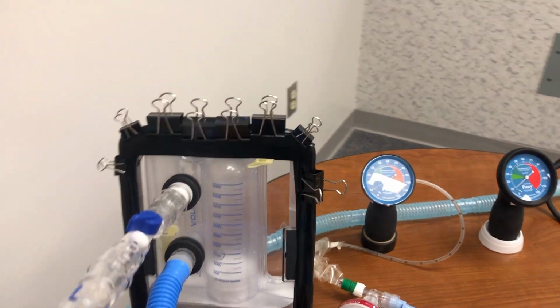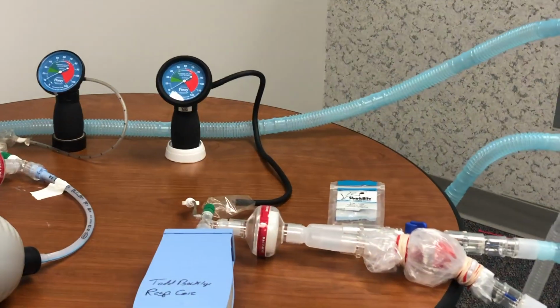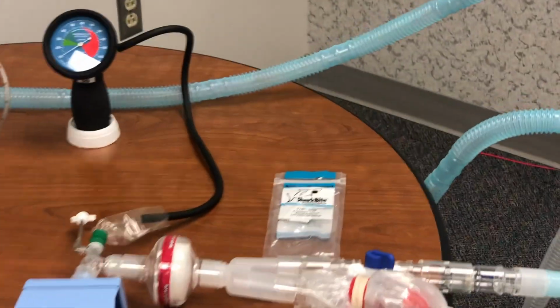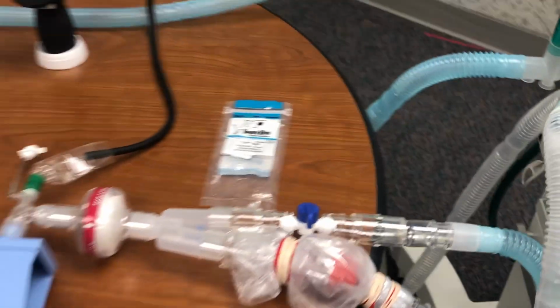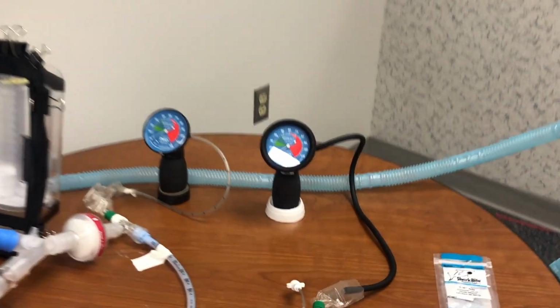Yep, it's 500. Now let's play two scenarios where, let's say, this patient is not doing well and codes. So basically I'm turning the valve off. No pressure, no valve.